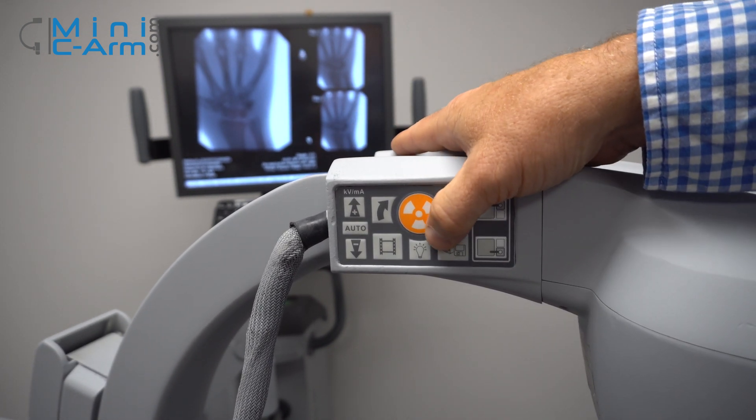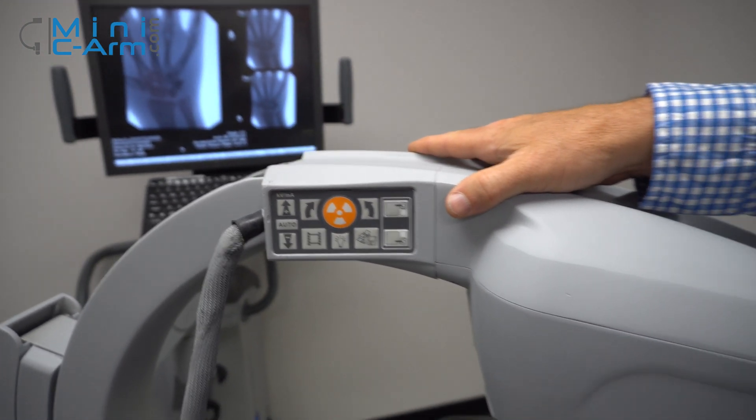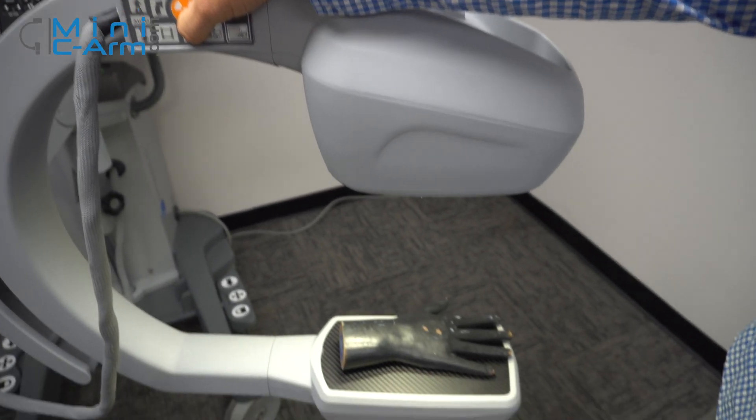This is the only machine on the market that can light your sterile field. It's a toggle on and off.